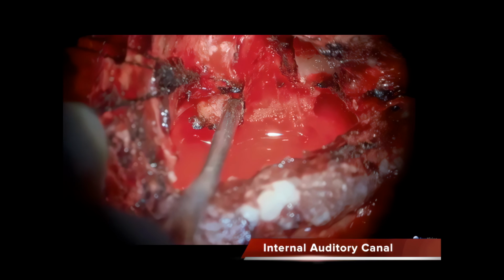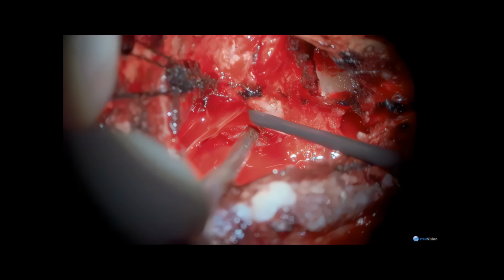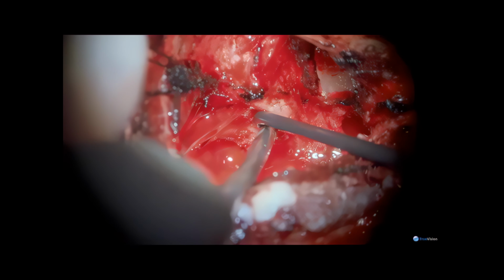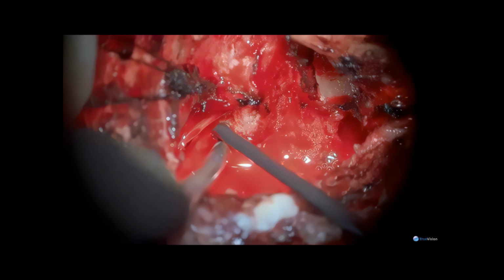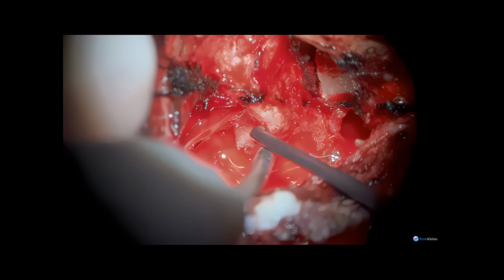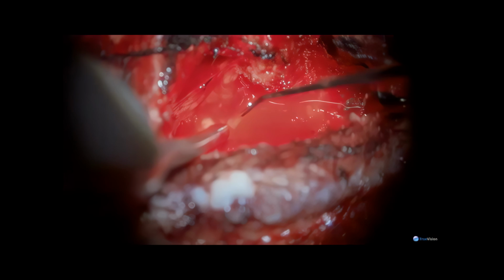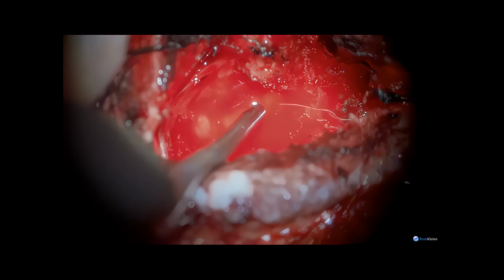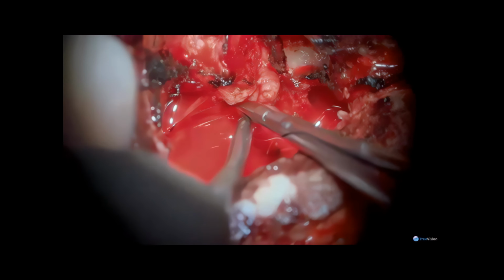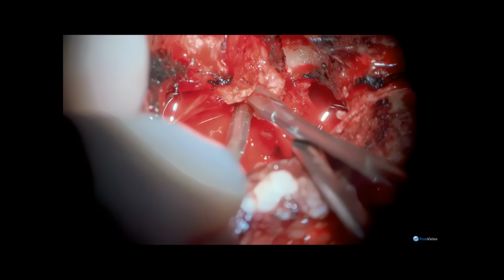Once the entire intracranial portion of the tumor has been removed, the very last segment of the procedure involves carefully separating the tumor remnant in the internal auditory canal from the facial nerve. I use gentle dissection and continuous monitoring with an EMG stimulator to achieve a total removal of this very large tumor.